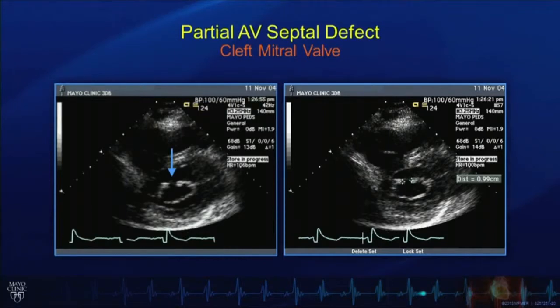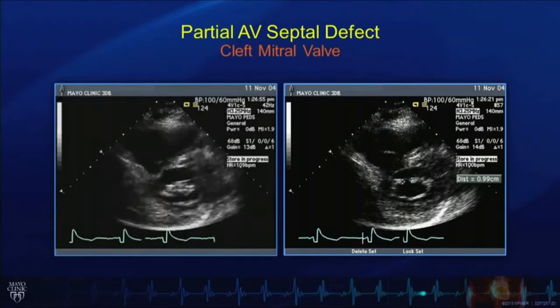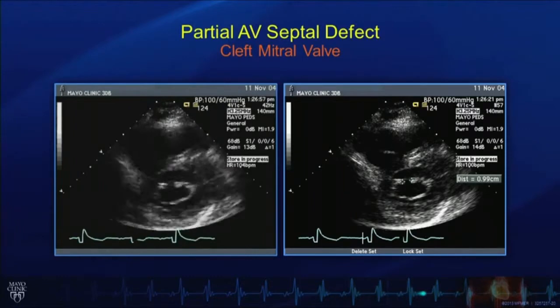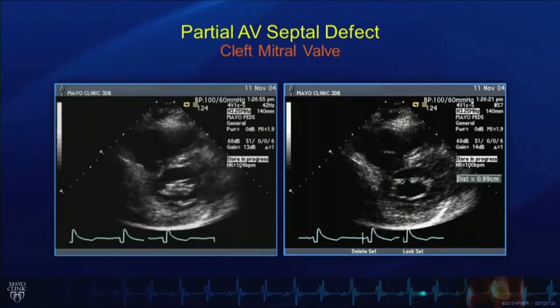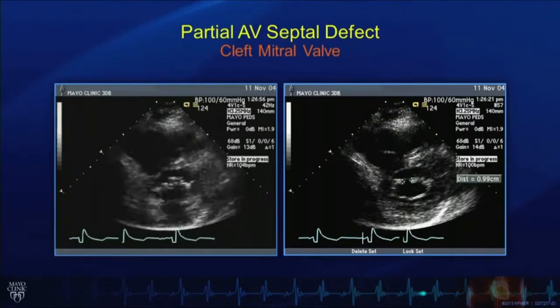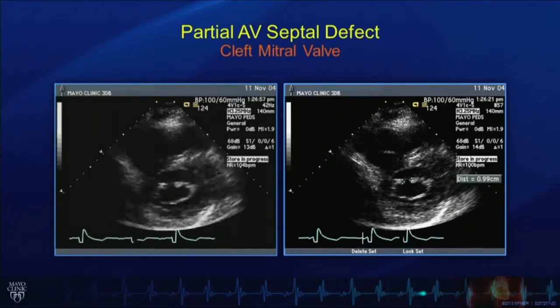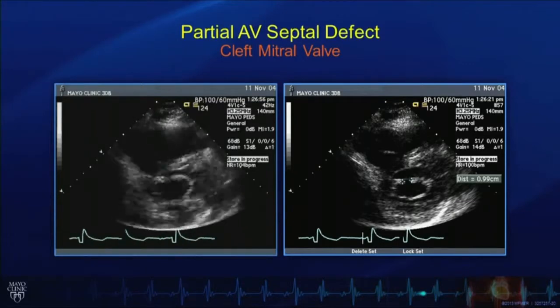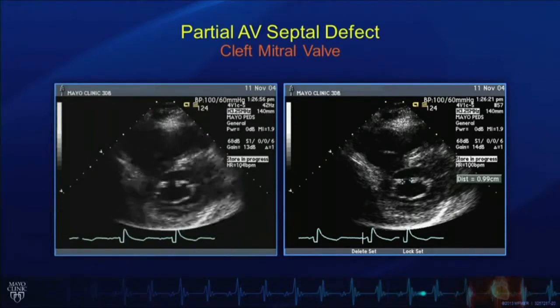Other associated defects with this primum defect or partial atrioventricular septal defect are important. We've already alluded to the cleft mitral valve, as demonstrated in these short axis images. The image on the left with the arrow demonstrates a large cleft, and as we look at that in real-time, we can see that there would be important mitral valve regurgitation associated with this cleft. It is always important to look for it and very important to close at the time of operation. The image on the right demonstrates a measurement of the cleft size, which is close to one centimeter.